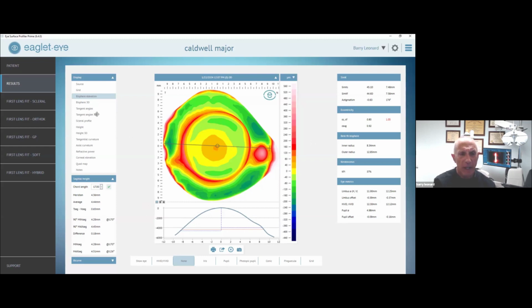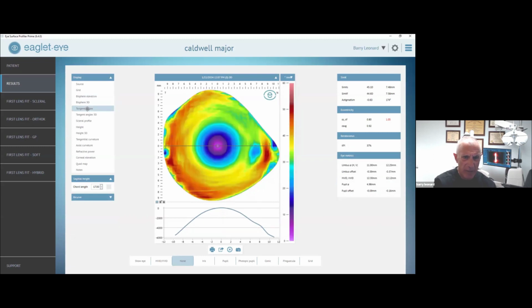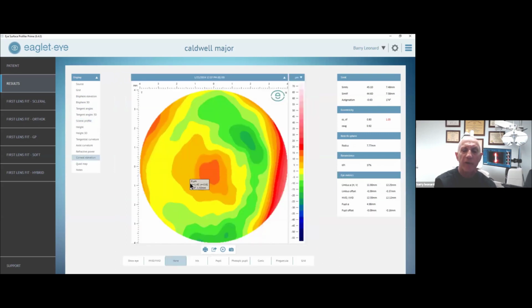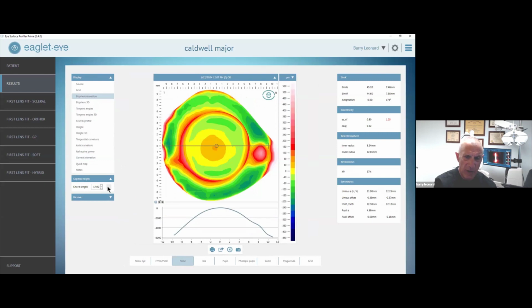And that's the main thing. Some people I'm going to show different scans, depending on what they like to see, and we need to show them. There's a lot of things here, and even the corneal elevation maps. There's your cone, and a lot of good data here to use. But again, the main thing is this, and then I can start right in the chair with them.